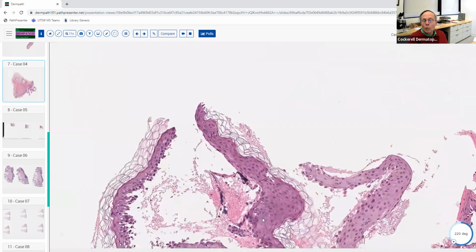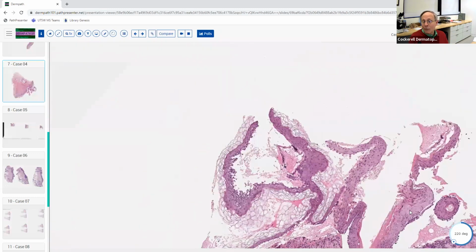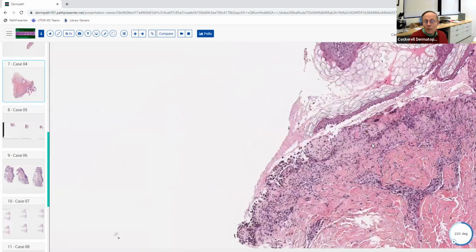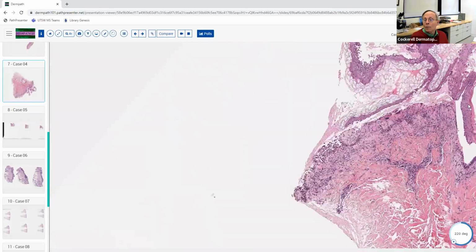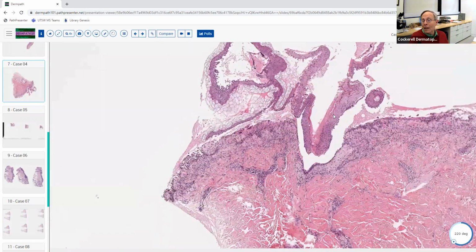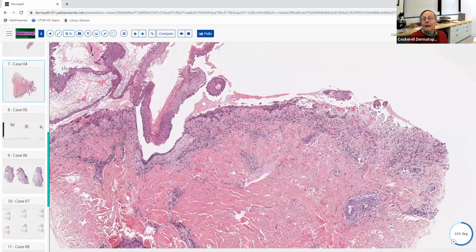Always look at the roof of the blister. If it's pretty thick like this, it means it had to be pretty much a suprabasilar split, because if this were superficial pemphigus, the roof would be up here and very, very thin. Here most of the epidermis is comprising the roof. You have a few acantholytic cells sitting at the bottom, and then you have that tracking down the follicle. So don't look over here and say, oh God, that looks like a dilapidated brick wall, it's got to be Hailey-Hailey, when you've got all these other things screaming pemphigus vulgaris at you. So don't let that throw you off on a board examination.